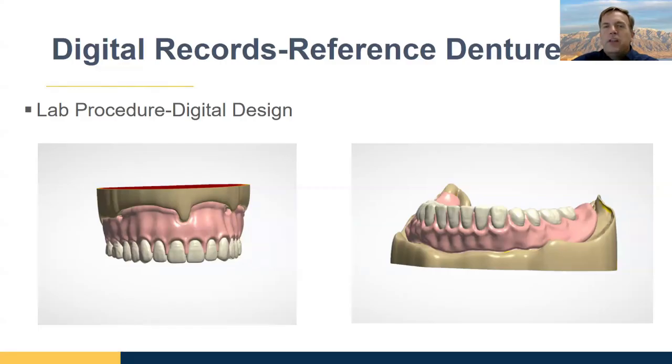It says, when choosing teeth, does 3Shape or exocad provide a tooth shape size proposal? Yes, they do. The 3Shape ones are not bad.